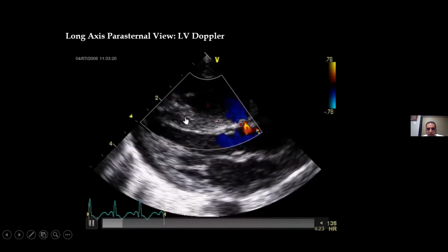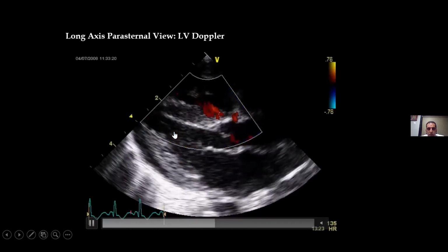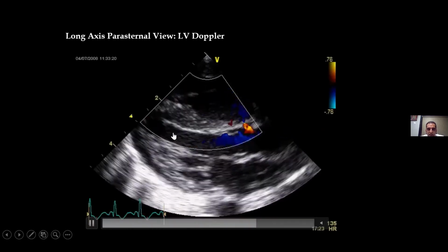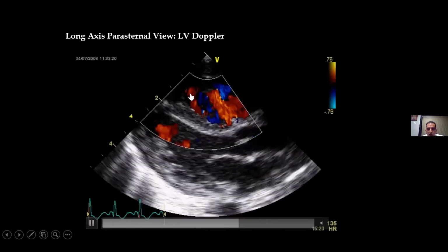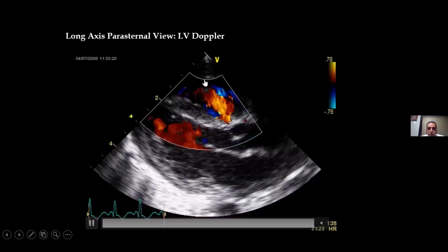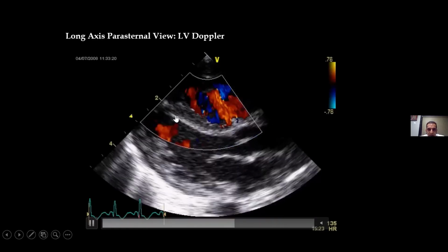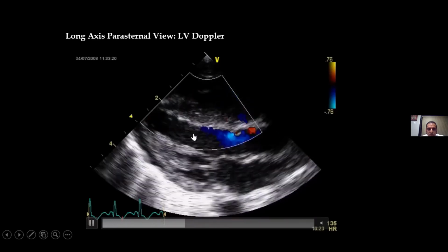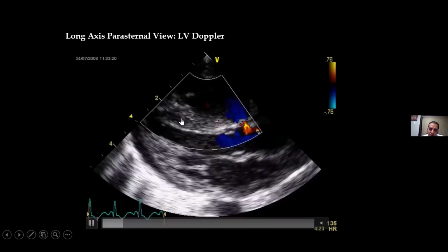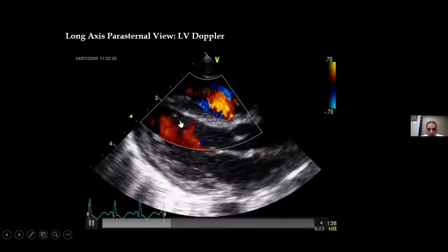Okay. Now, if you have a VSD, you see, this is your probe. If there is a VSD and your blood is flowing from LV to RV, so this is towards the probe, it will be red. And it is in line with the ultrasound beams. So you can do the Dopplers of the flow in the defect. And if there is a defect in this septum, the beams are perpendicular to it. So in this view, you can calculate the VSD defect size, and do the Dopplers of the flow of the blood in the beam.